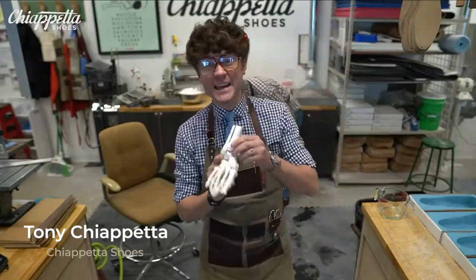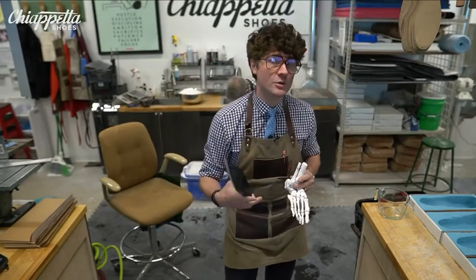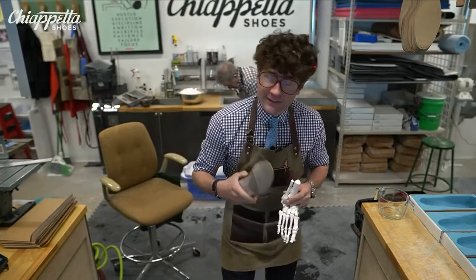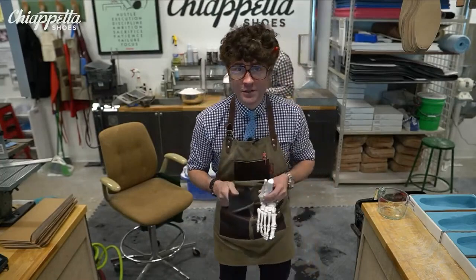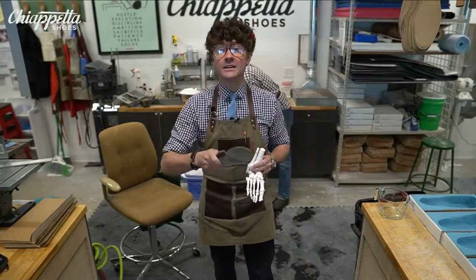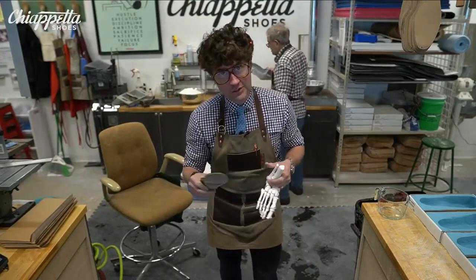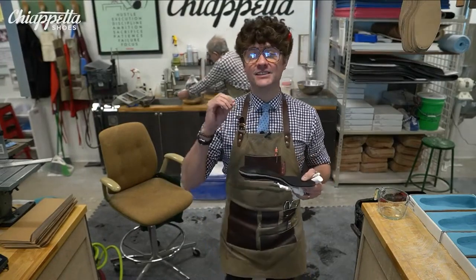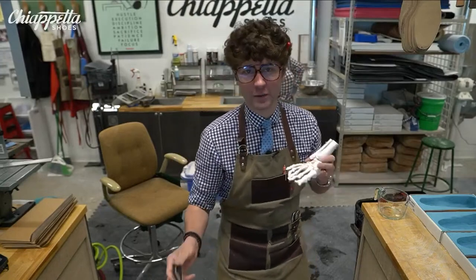We have a B7 foot type custom orthotic from 22. We're doing a new set. Nice lady, had a knee replacement in early of 22, had some complications with it, made a custom orthotic in late 22. Orthotic's been doing pretty well. We're doing two new sets, a standard insert and then a slim orthotic for your dressier shoes and things like that. But we're sitting down talking a little bit today.